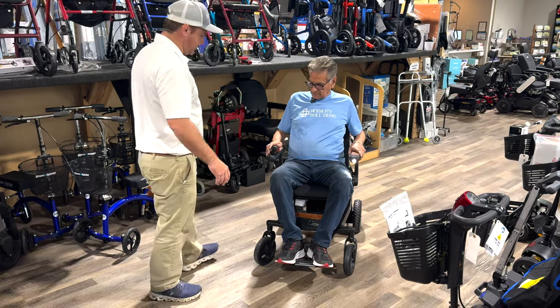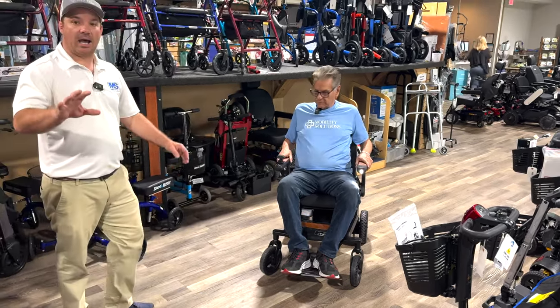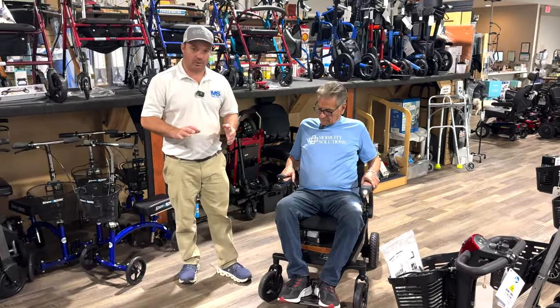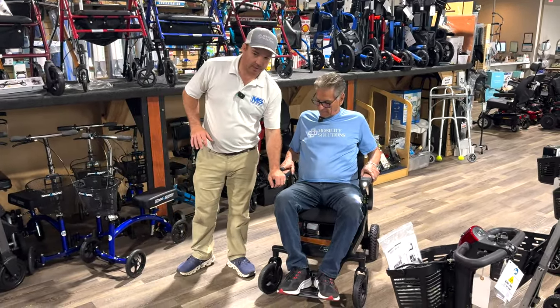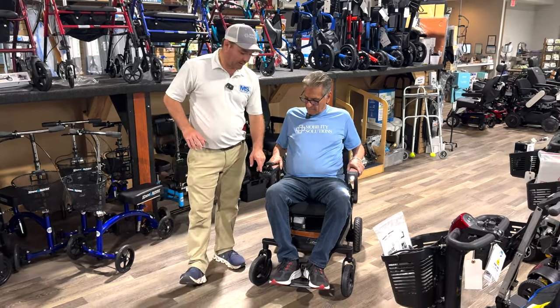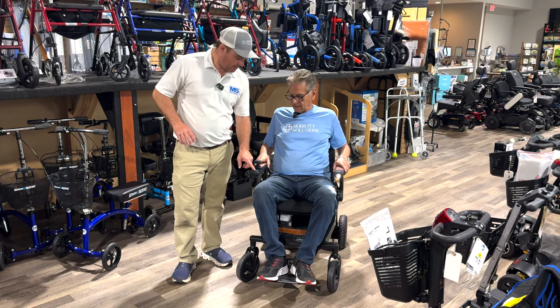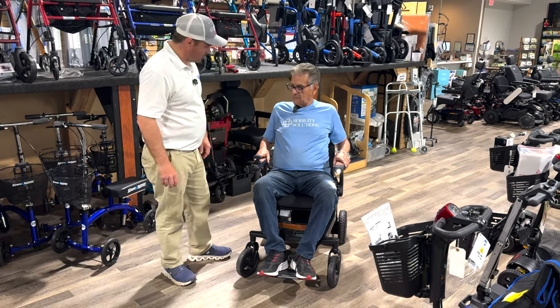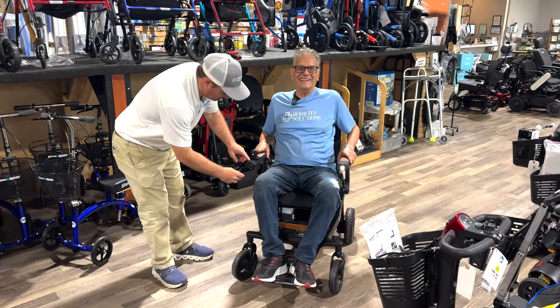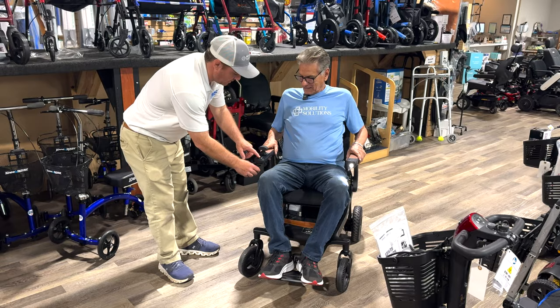That's speed two. How's it? See how it moves? All right. Okay, so it's locked. It's locked. And it's good that it's locked. This is very, very important. People hit the on button and it takes off when you hit the joystick. I actually locked it. When you turn this on, you always have to unlock it. So right here, unlock. And then look, listen to the horn. Let's get that real quick. Listen to the horn. And then it tells you if it's locked.